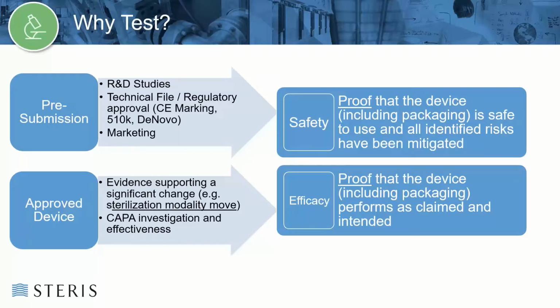So why test? Testing is intended to show the safety and efficacy of your device, and it's primarily linked to submissions to regulatory bodies. Pre-submission, you're going to do some R&D studies. In this particular case, for package testing, you're probably going to do some testing to show that your packaging design functions the way that you intend it to. It protects your device the way you want it to, holds the device the way you want it to.